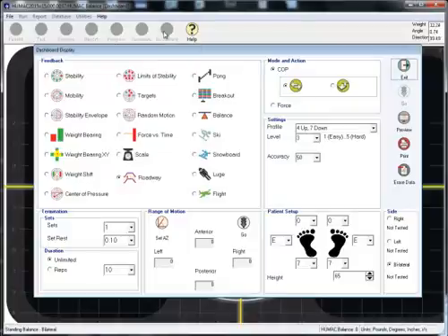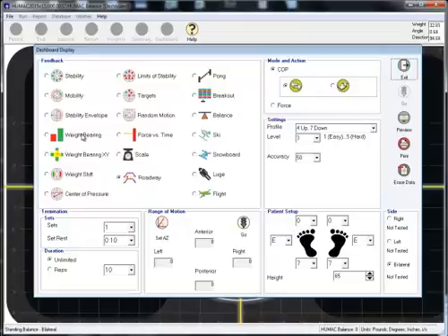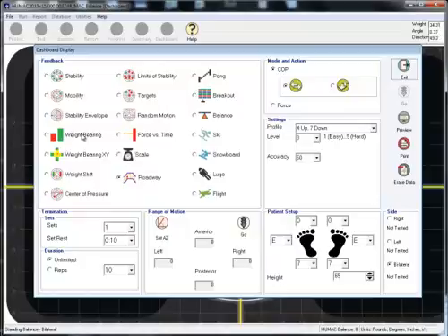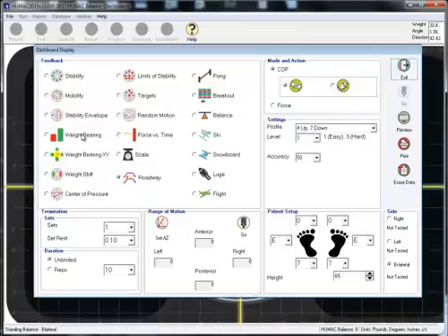Now I need someone to play the role of the patient. Patient, please remove your shoes. If you have socks, you may leave them on. Stand on the balance board, feet centered on the board, and feet under your hips. It might be helpful to march in place a few steps to position your feet under your hips. Arms should be at your side or crossed in front of your chest.